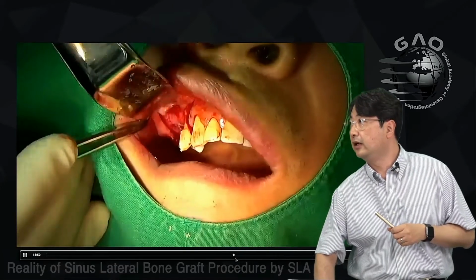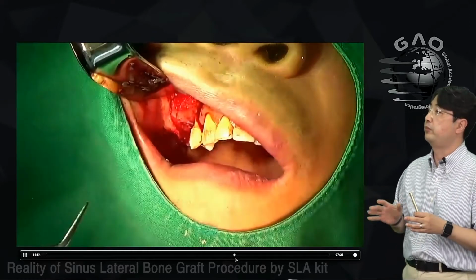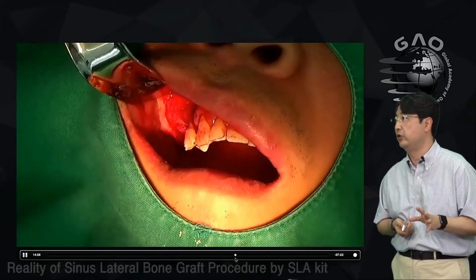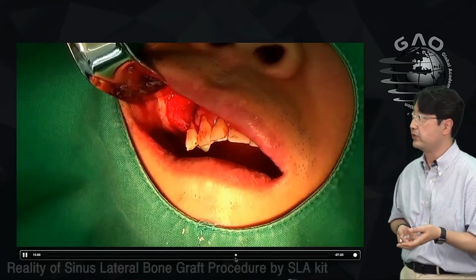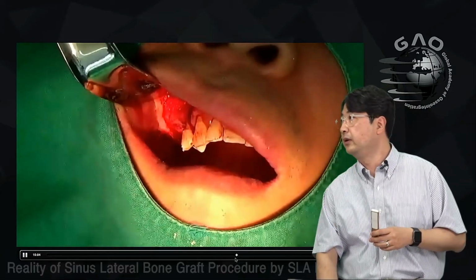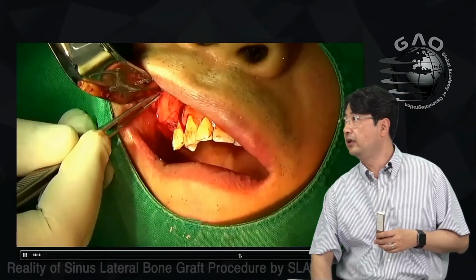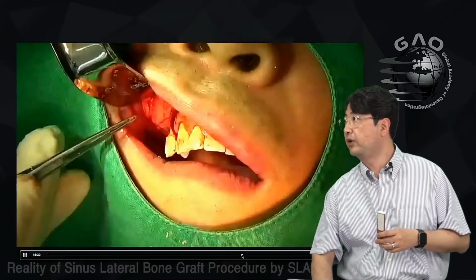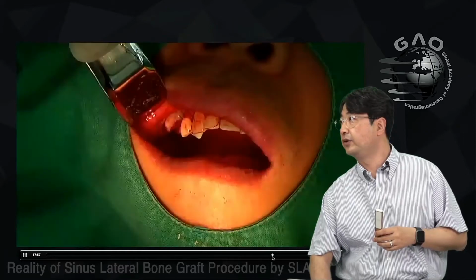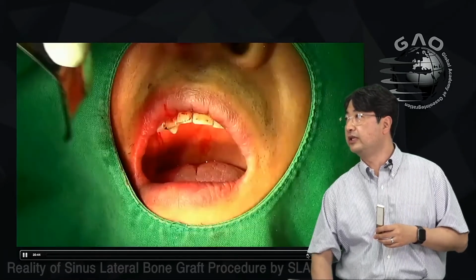Then I cover the anterior opening with the PRF membrane. And in this case, I haven't created the window. The window was already there, so I covered it with the PRF membrane because it was too big, right? Then I placed the PRF membrane, and I made sutures to close the wound. So this is how it worked.